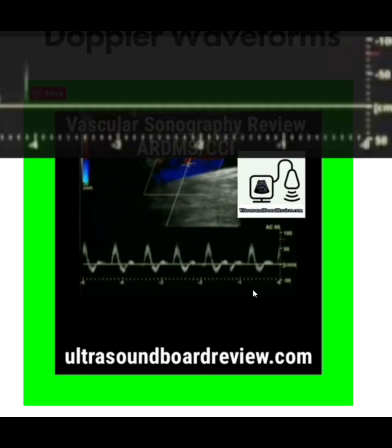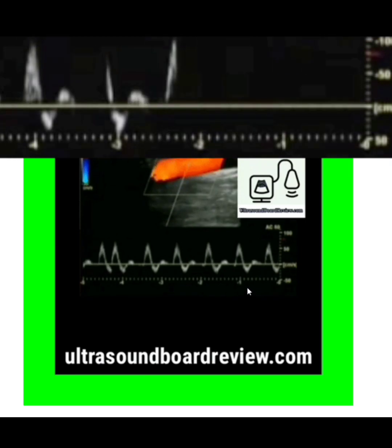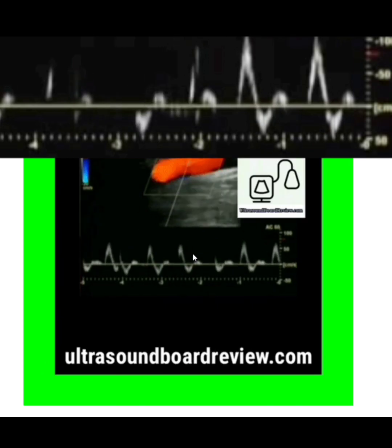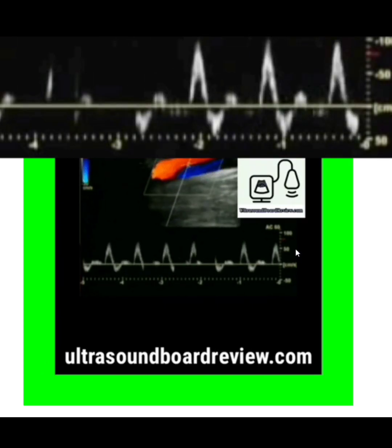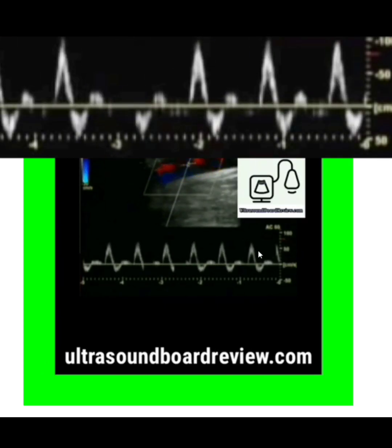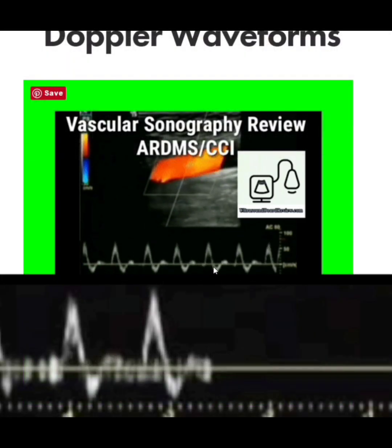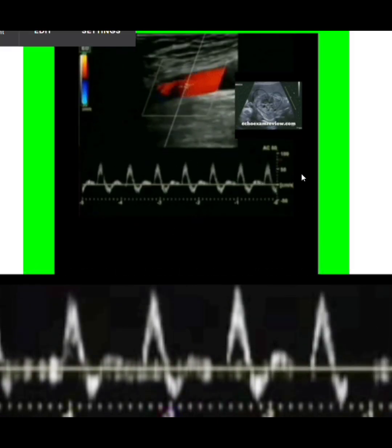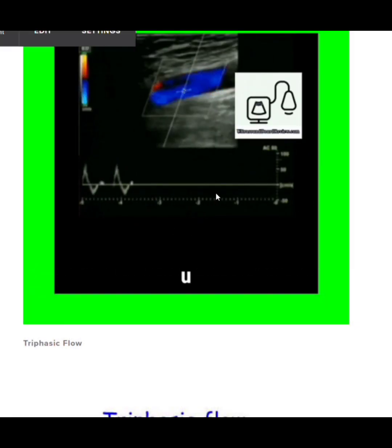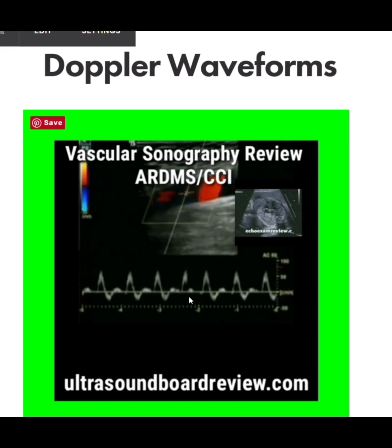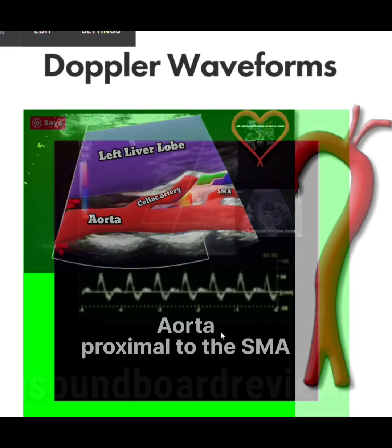The first waveform we're going to talk about is a triphasic pulsatile waveform. This shows high velocity and high resistance flow. We know this is high velocity because we can compare it to the velocity scale, and we know it's high resistance because there's very little to no flow during diastole. These types of waveforms can also be referred to as laminar flow.